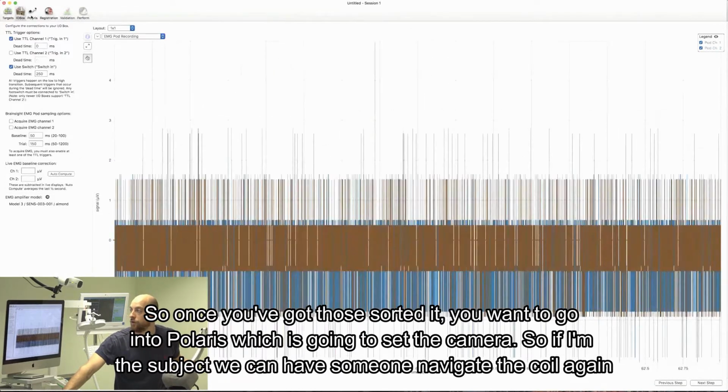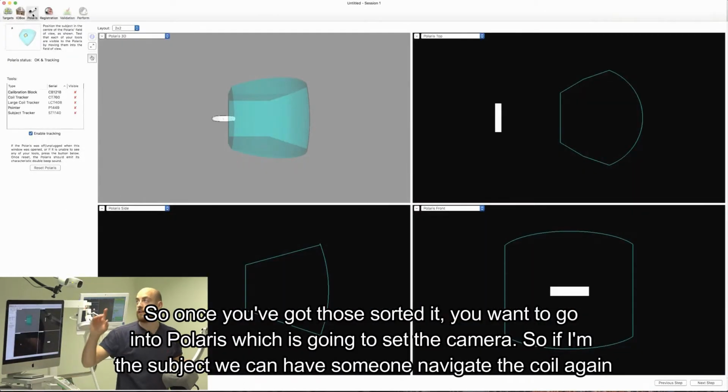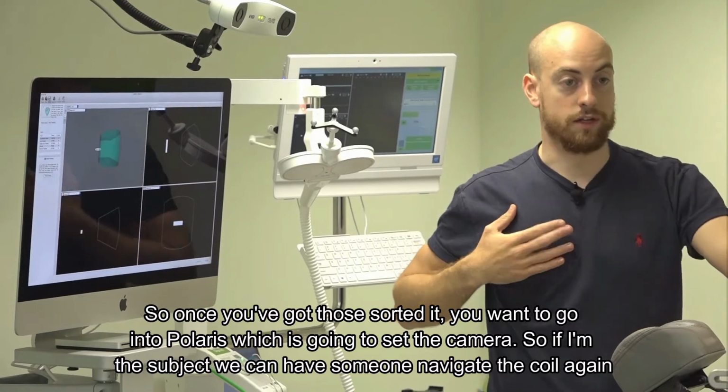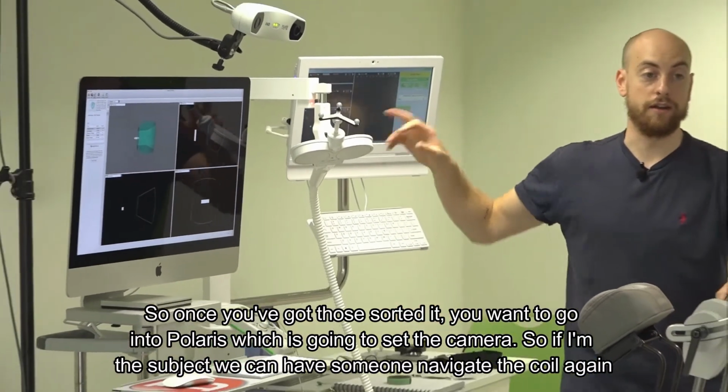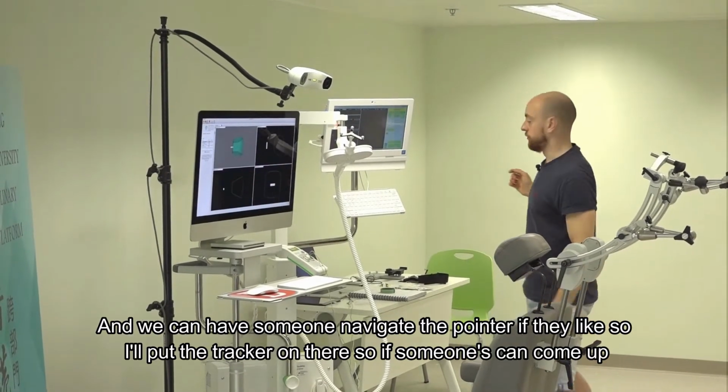Once you've got those sorted, you want to go into Polaris, which is going to set the camera up. So if I'm the subject, we can have someone navigate the coil again, and we can have someone navigate the pointer if they like.